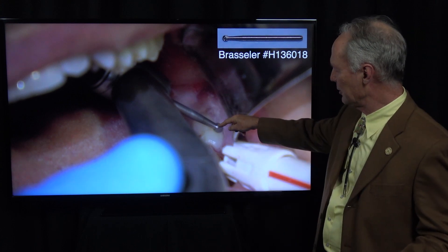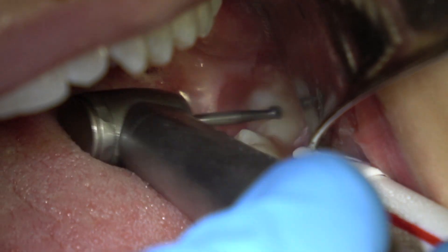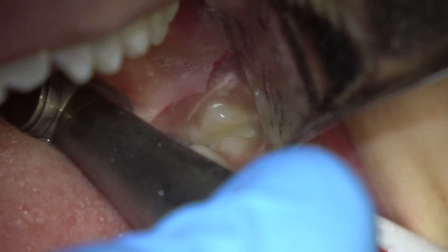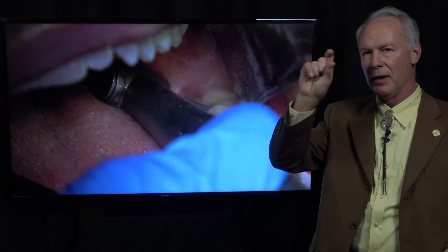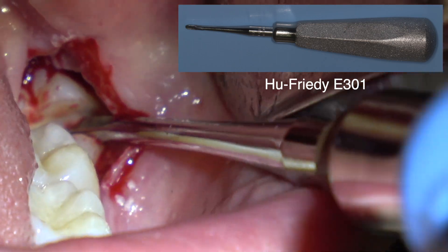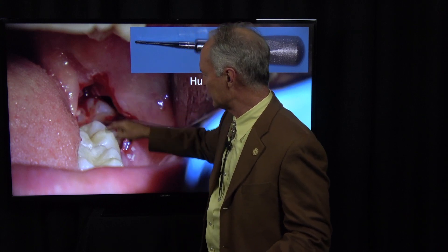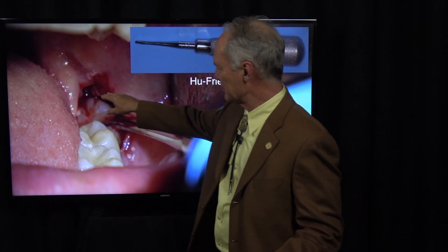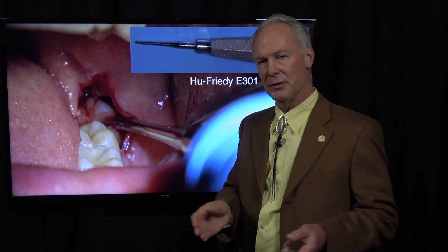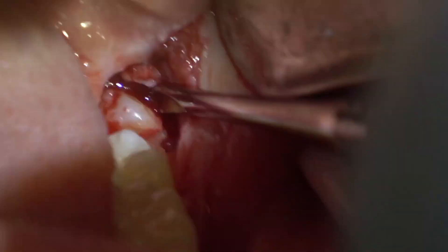I'm going to cut through the occlusal surface to the furcation — lots of water, very light touch around the distal, and now through from the occlusal to the furcation. I want to cut all the way through. I've measured this ahead of time with my application on my computer with the periapical radiograph. This is a Hugh Freedy E301. I'm elevating this piece into the space I've created distal to the tooth. When creating that space distal to the tooth, try to cut the tooth and not the bone — you just want space, and you're losing the tooth anyway.